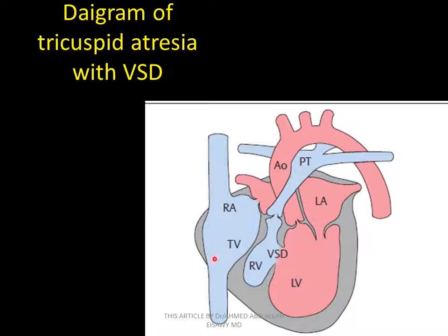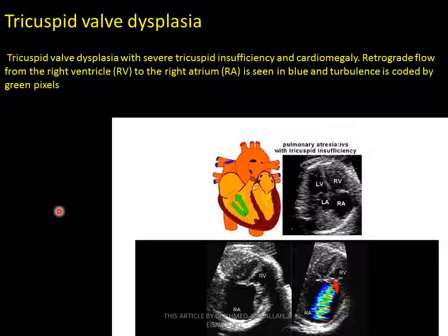Tricuspid atresia with VSD: right ventricle, left ventricle, left ventricle and left atrium, right ventricle and right atrium — enlarged right atrium, tricuspid atresia. Blood goes through left ventricle to right ventricle. This is the pulmonary artery — tricuspid atresia with enlargement of the right atrium and VSD, small right ventricle, hypoplasia of the tricuspid valve. Tricuspid valve dysplasia with severe tricuspid insufficiency and cardiomegaly — retrograde flow from right ventricle to right atrium seen as blue turbulent flow coded by green pixels.